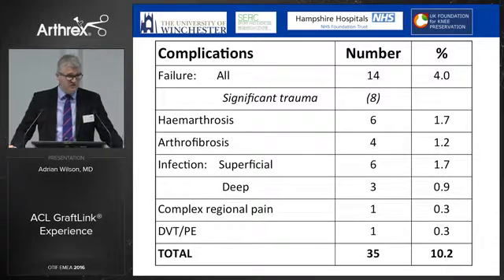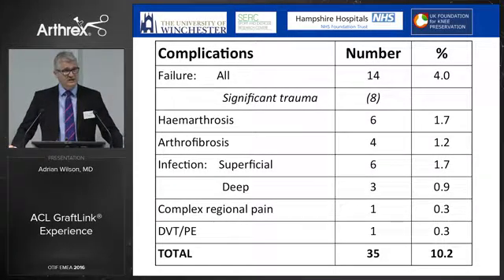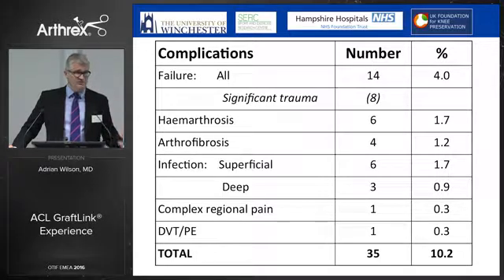We had no infections for 250 cases, so I thought we were never going to see an infection ever again, and then actually we had 3 on a trot. It must have been something to do with sterilisation. In a period of about 6 weeks, 3 infections that were deep, and we've had none since. This is not an operation that often is problematic with infection, but we found a low infection rate and also serious complications very low.